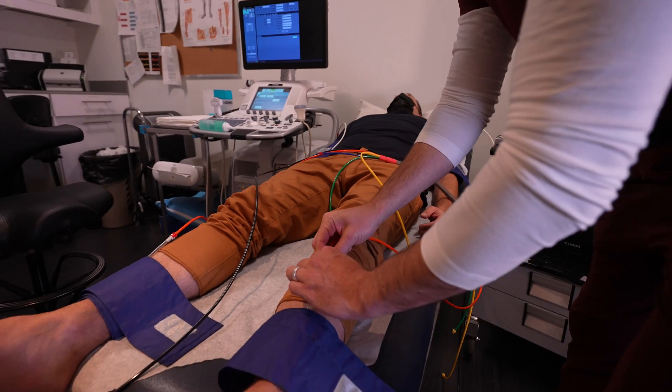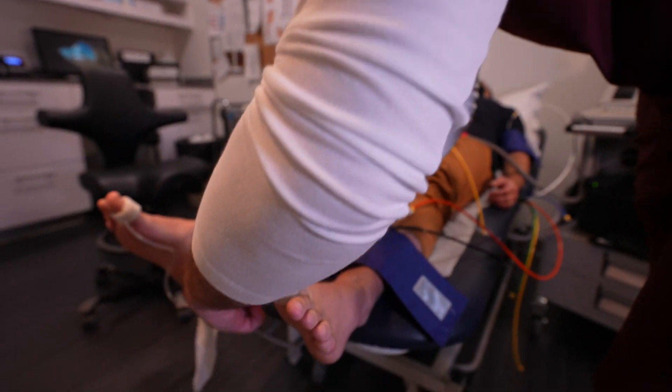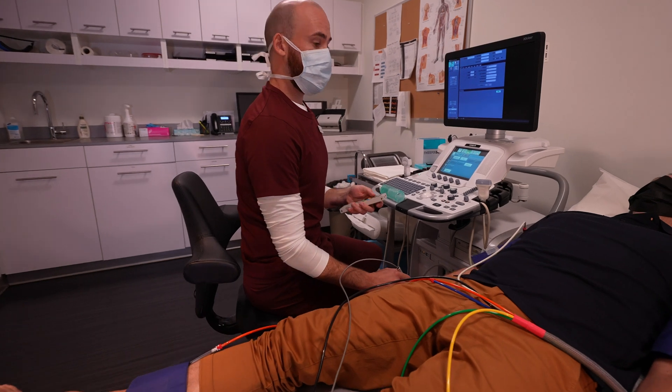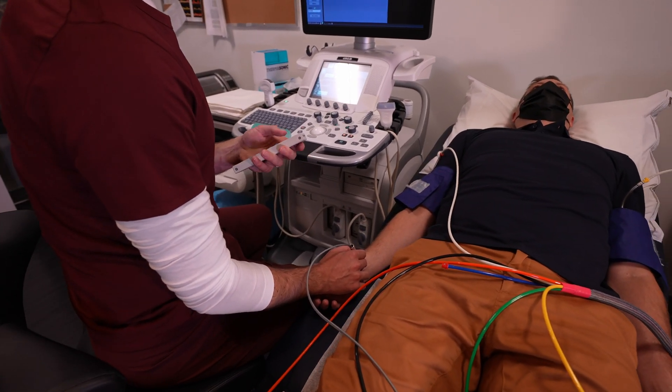This gives us an index of how the blood is flowing down to the feet and is often the first port of call to rule out any vascular disease. We typically perform this test for patients who have leg swelling or varicose veins, and it's used as a measure to ensure the patient is safe to have compression stockings.